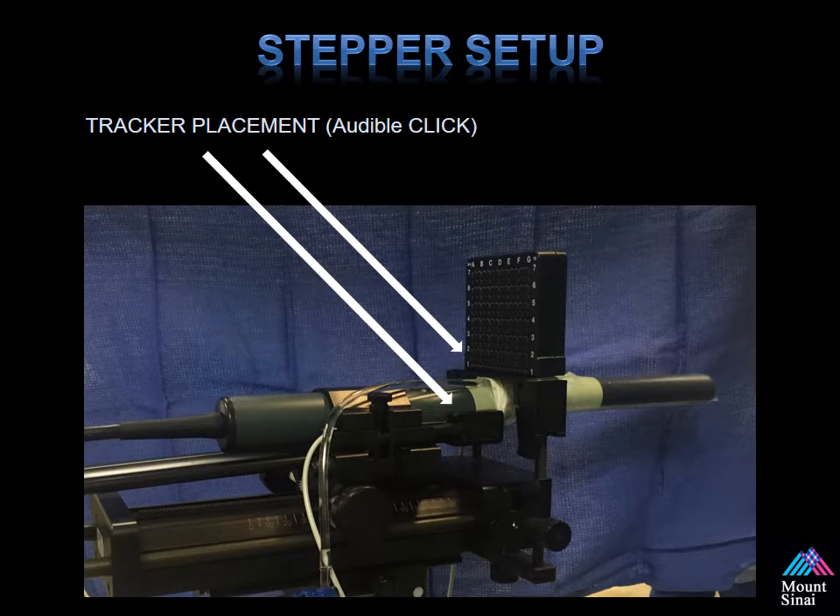Setting up the stepper is simple. Please connect your trackers to the shown locations — this will allow for tracking of your ultrasound probe. You must have that audible click to make sure the trackers are in place. Also, when placing your grid, please make sure that's done in a secure fashion, because then you'll have perfect alignment when you do your procedure.